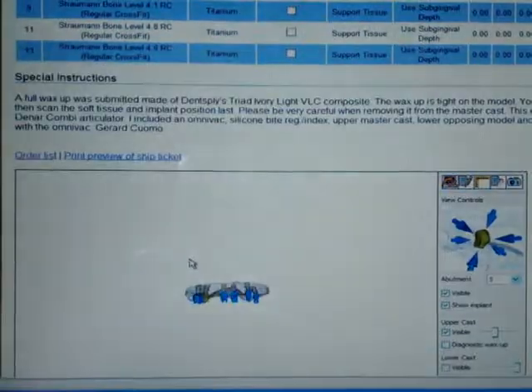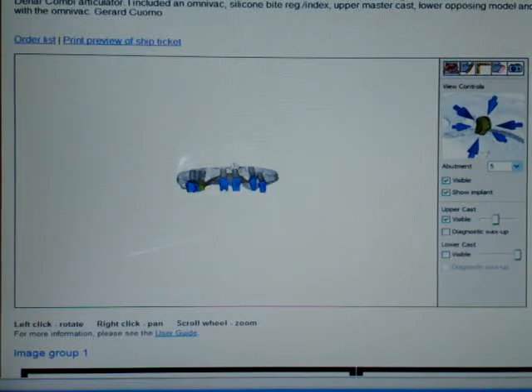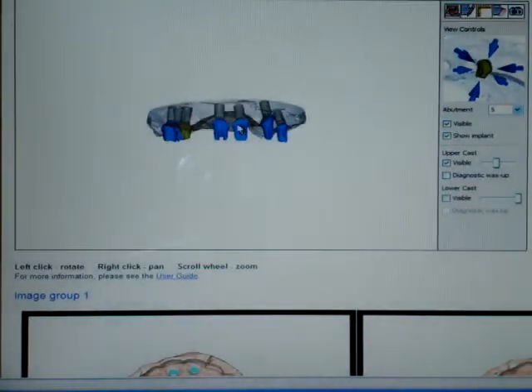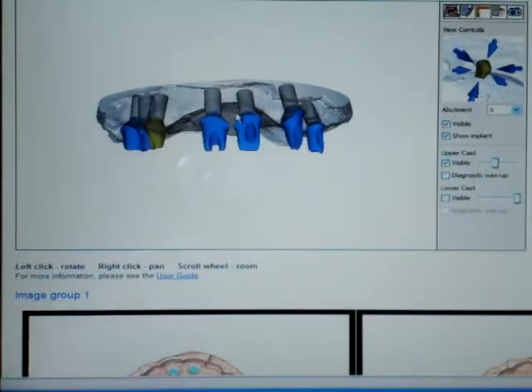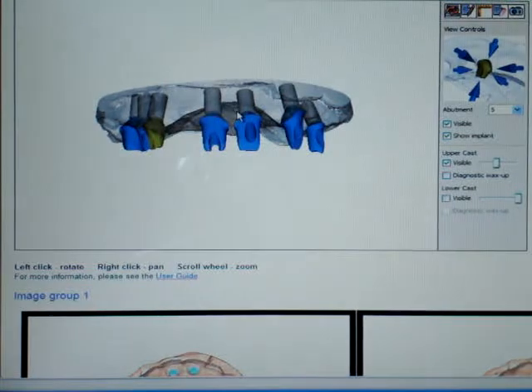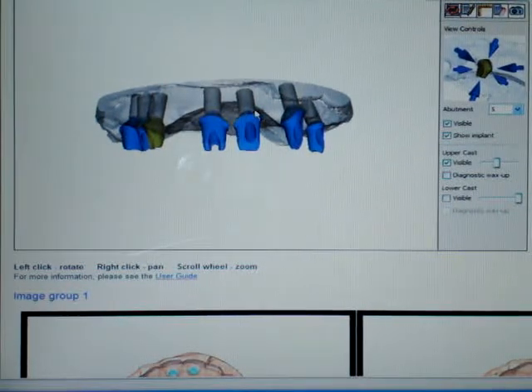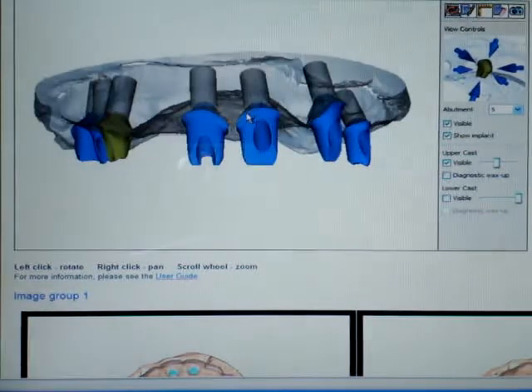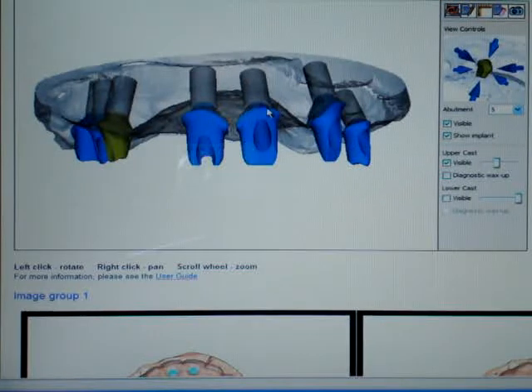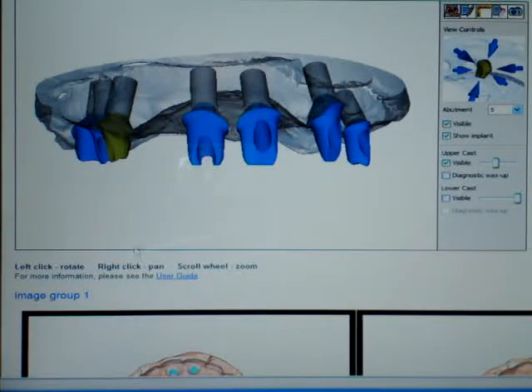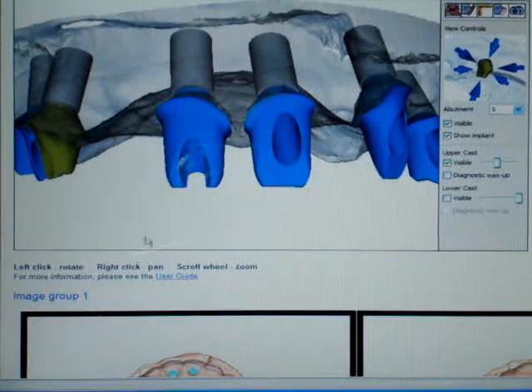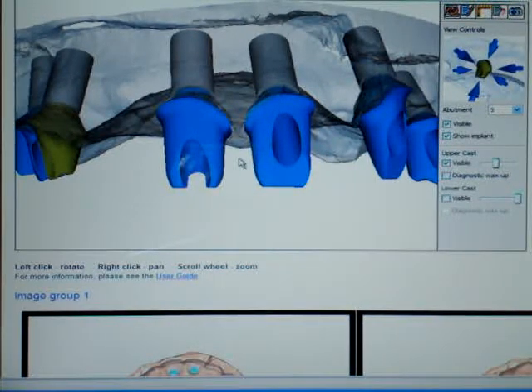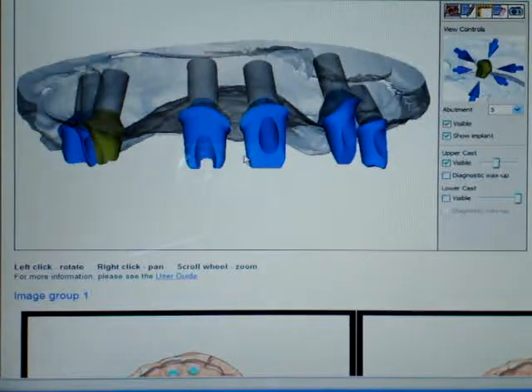All right, so here's the case. Now we're going to, it pretty much gives you your case in the middle. You just push down your scroll button or your scroll wheel and just kind of scroll that forward. So that's the zoom. Now, if we want to move this around, you're going to left click to rotate, right click to pan and scroll the wheel to zoom. I'm going to drop back the zoom a little bit.